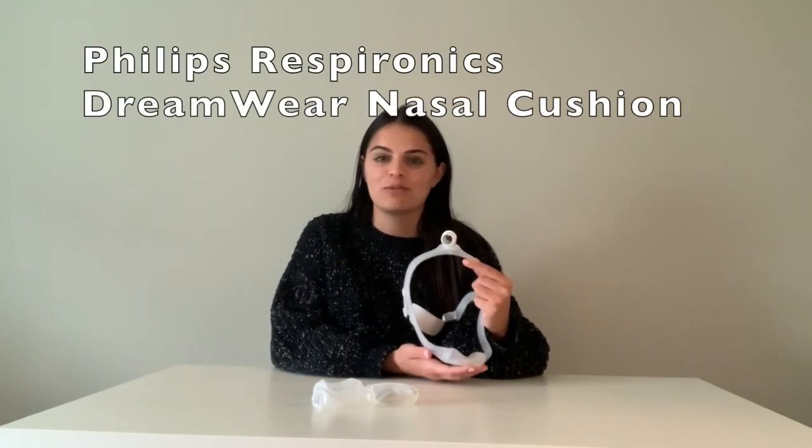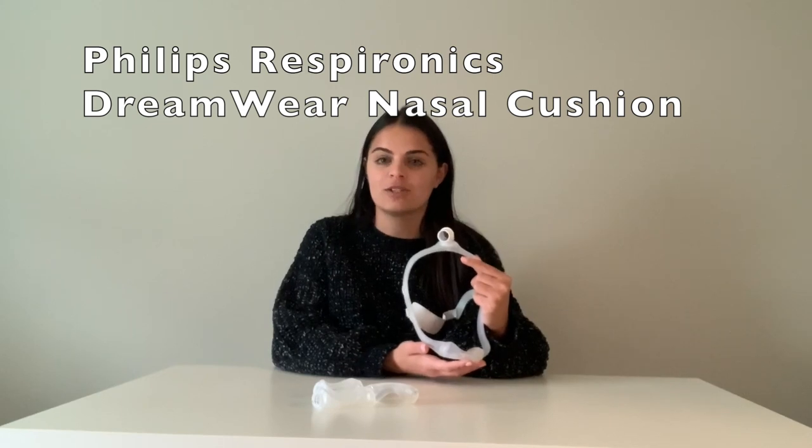Hello, my name is Carly from the CPAP Shop and today we'll review the Philips Respironics DreamWear Nasal Cushion. The Philips Respironics DreamWear Nasal Cushion has a unique design that gently shapes the nose to create a secure and lasting seal. It features a soft material so that users can have less irritation and red marks on their face. Because of its design, this nasal cushion sits under the nose, providing less contact and an open line of vision.